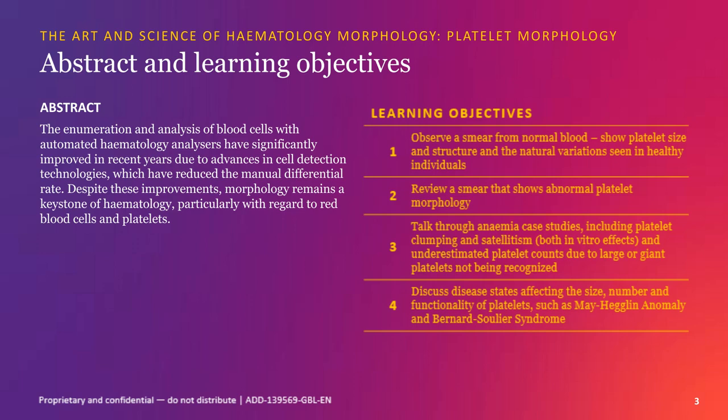Today's learning objectives are: observe a smear from normal blood showing platelet size, structure, and natural variations seen in healthy individuals; review smears showing abnormal platelet morphology; and talk through platelet case studies including platelet clumping and satellitism — both in vitro effects — and underestimated platelet counts due to large or giant platelets not being recognized.